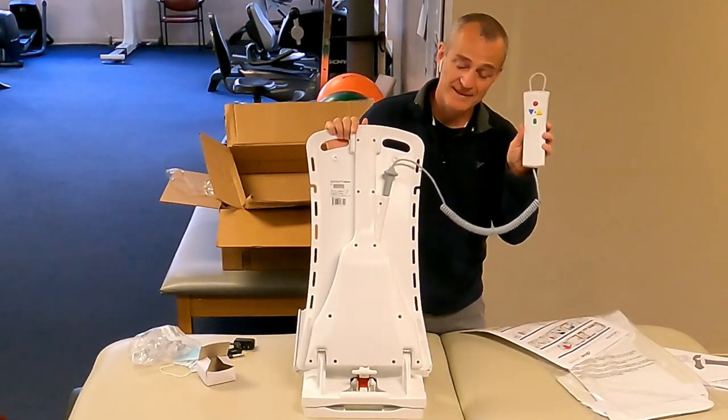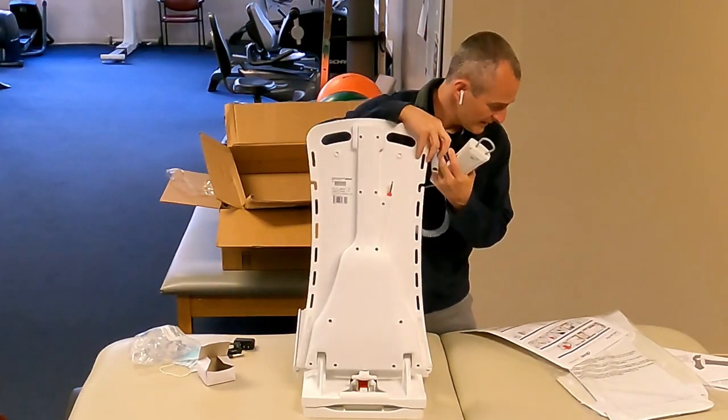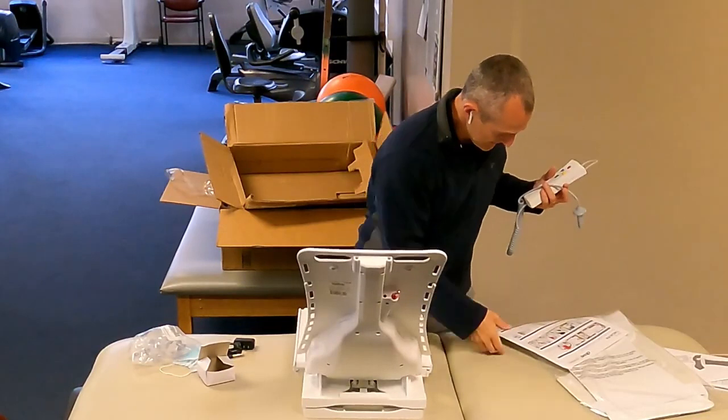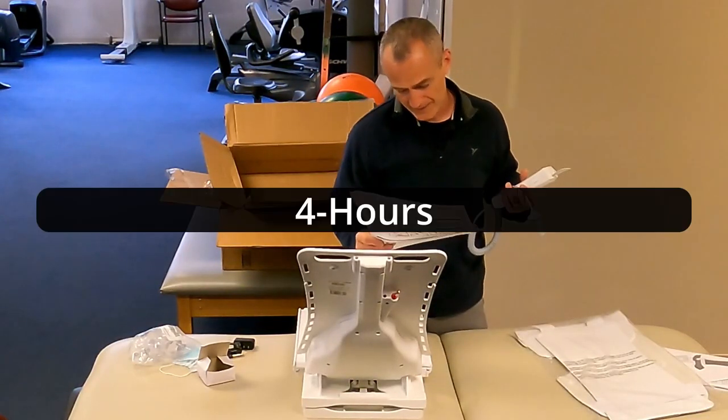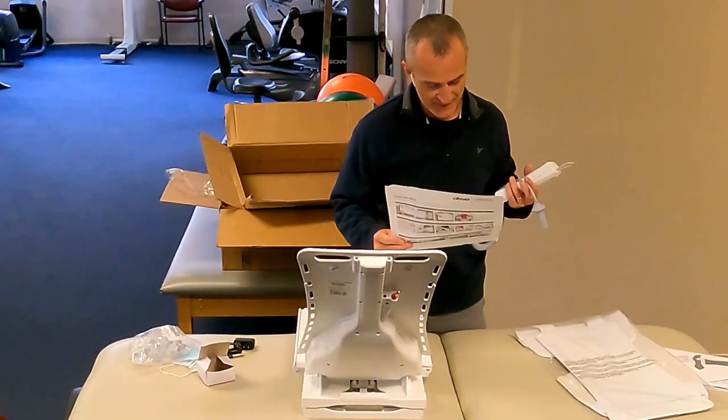First thing we need to do is get this charged, so bear with me. I'm going to do a little reading to see how long we need to keep it plugged in for a full charge, and then we'll test out the device.